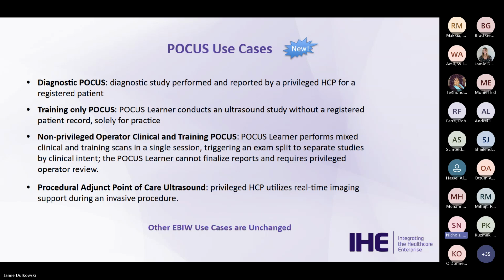And then the third use case is the mixed use case, which we see quite a bit at teaching hospitals, where you have a POCUS learner that's performing a mixed study on a registered patient. In this case, the learner would actually ask the patient, "Hey, while I'm here, do you mind if I scan your kidneys?" And usually the patients agree to that. So in addition to their clinically indicated studies, they may have some training studies as well. And all of these studies need to be sorted out accordingly within the POCUS manager. And so we cover that in this particular use case.